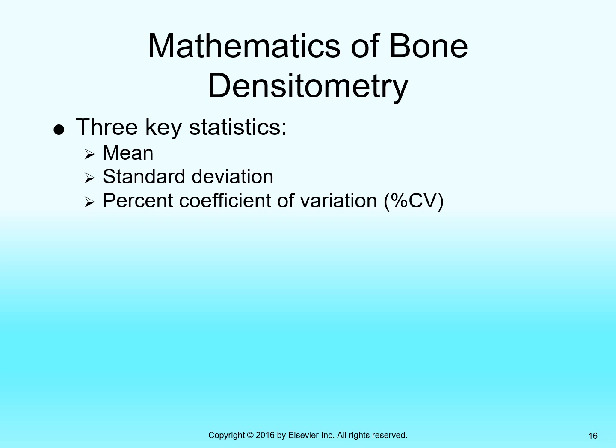Well, is the 12 really different, or is it different because you got scanned on a Philips machine instead of a GE machine and the software does the calculation just a little bit differently? That's where coefficient of variation comes in. They can manipulate the numbers a second time and get a relativistic comparison across different machines.